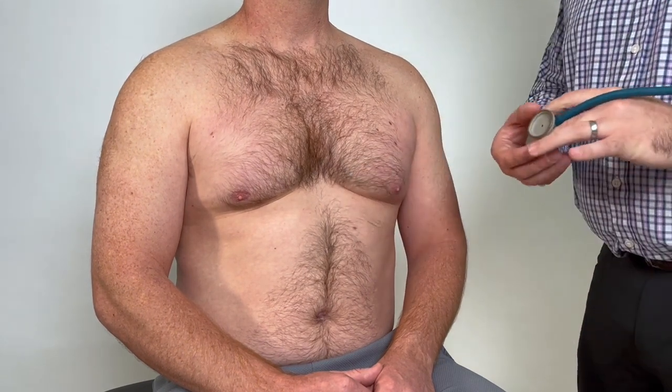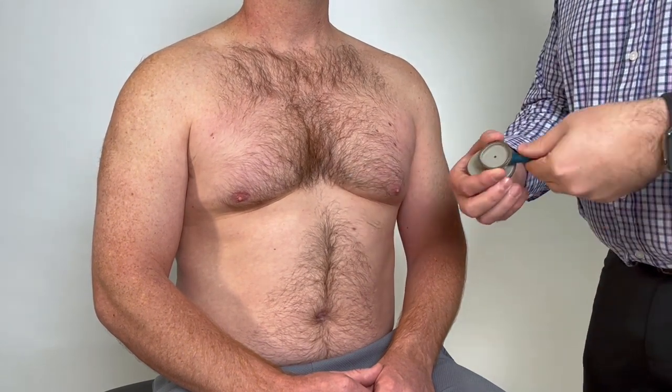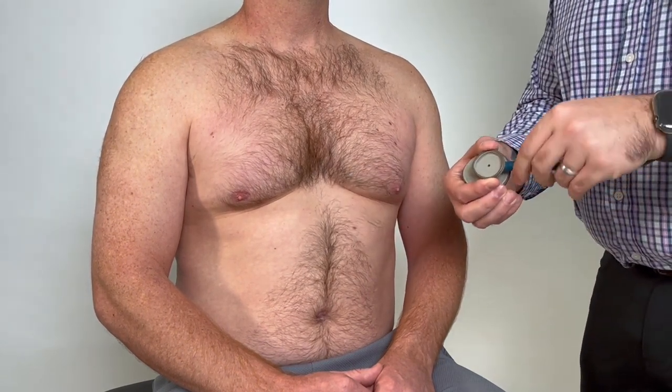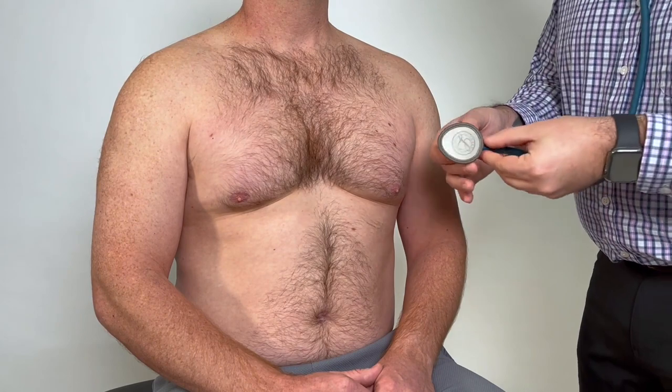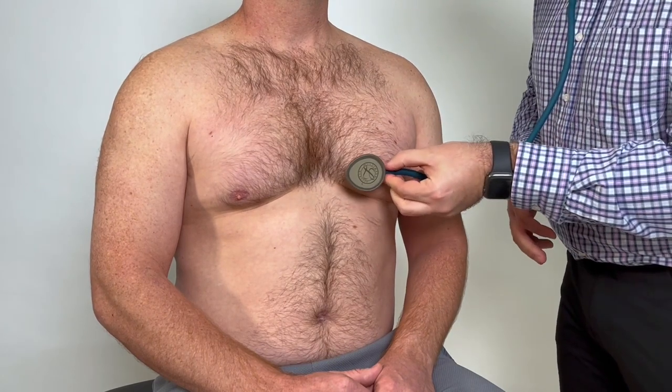Once you listen to the mitral region with the diaphragm, rotate to the bell and listen again, as it is better at detecting lower frequency sounds.